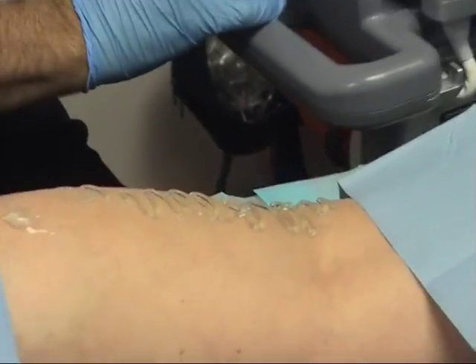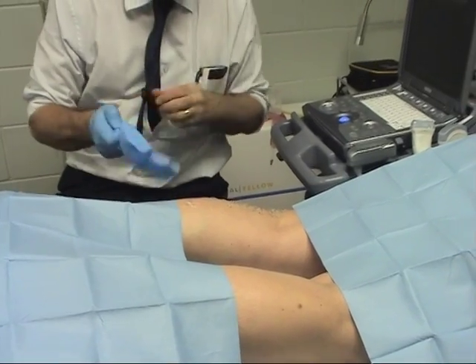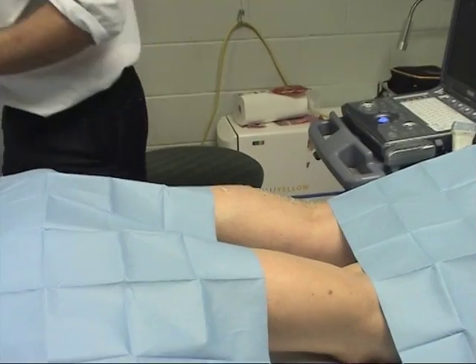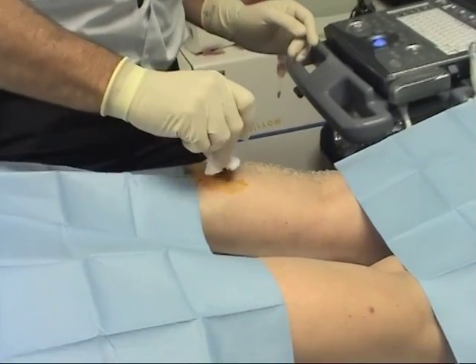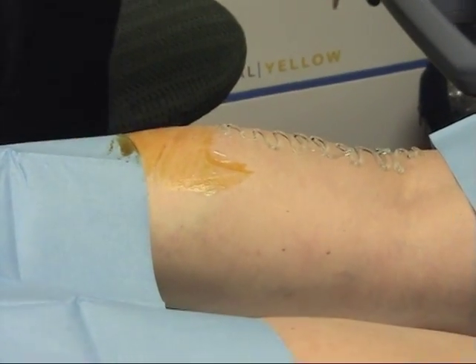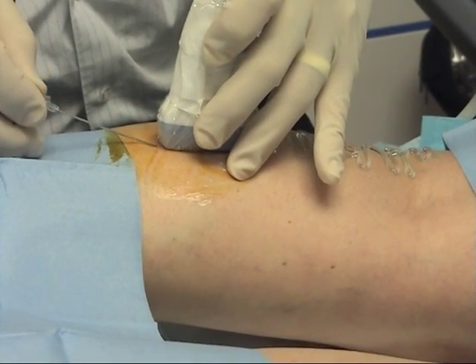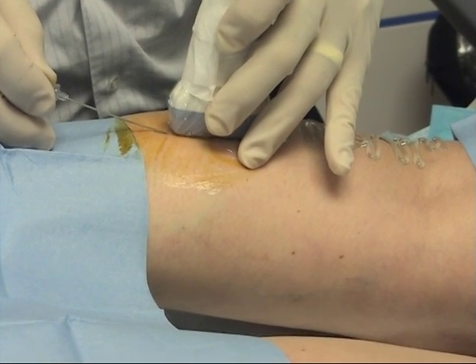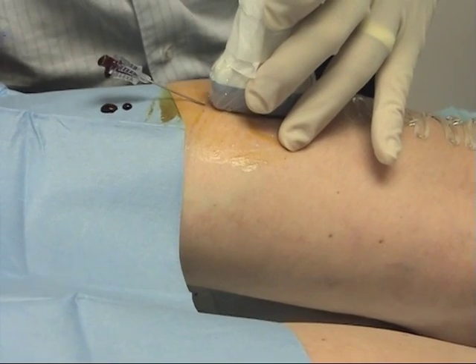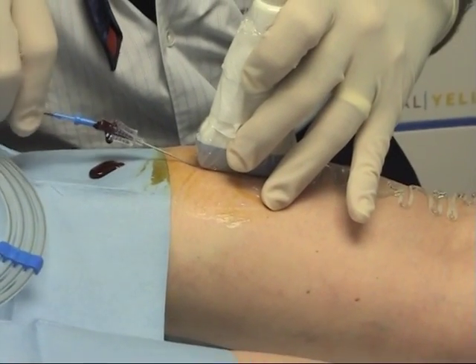So that should be numb for what we do there. You'll feel a bit of pressure — sometimes you're aware of the needle as it goes into the vein, but most times not. I'm just going to put some iodine on your skin — iodine solution just to sterilize that part of the skin. You're going to feel a little pressure. It should be in the vein. And we just put the guide wire inside there.